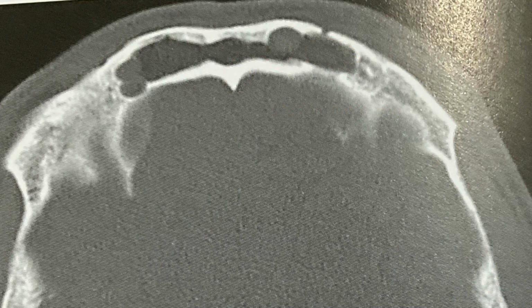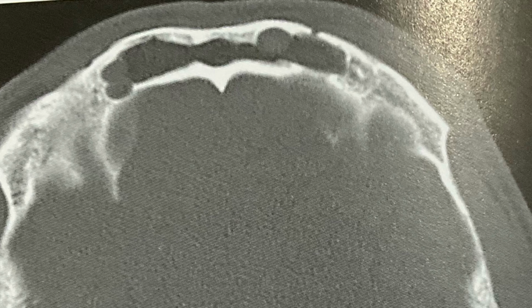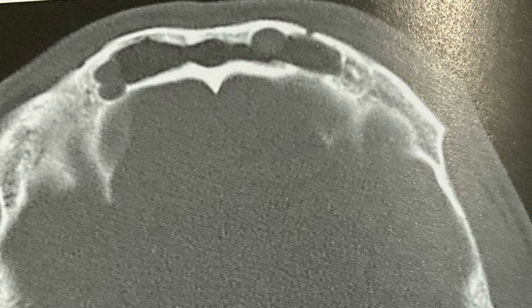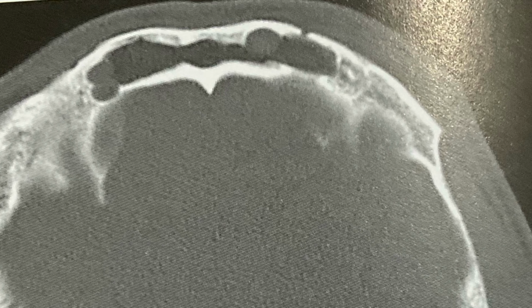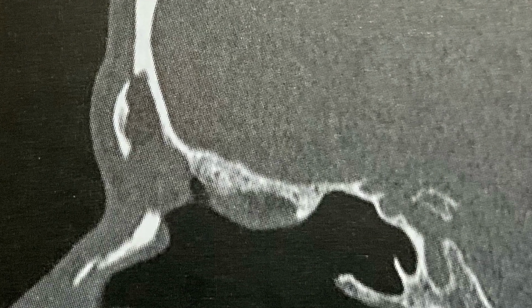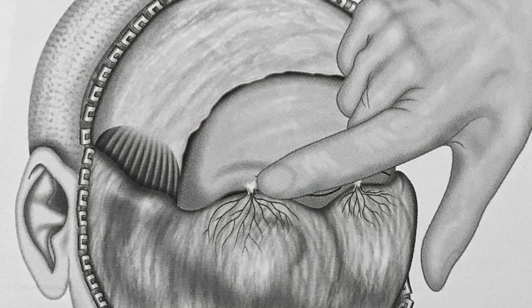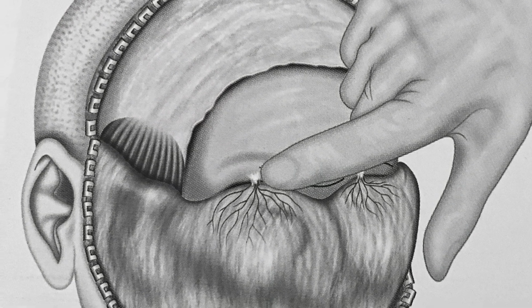The procedure starts with meticulous preoperative planning. A bicoronal incision is carefully designed to minimize scarring and preserve hairlines. Local anesthesia with epinephrine is used to reduce bleeding. Once the incision is made, the surgeon elevates the scalp while protecting critical structures like the supratrochlear and supraorbital nerves.